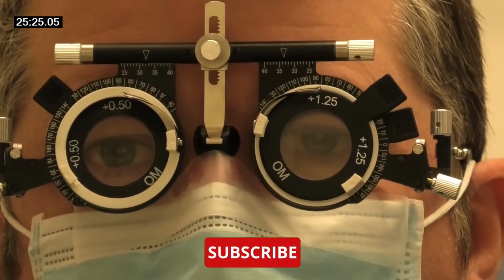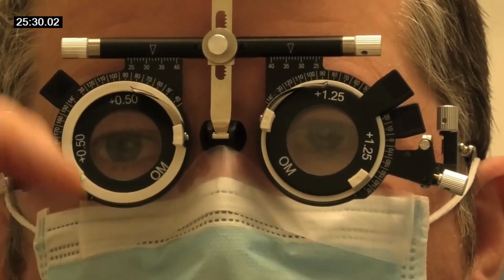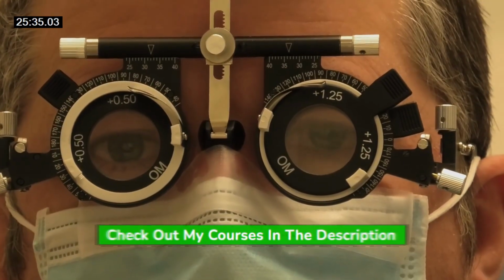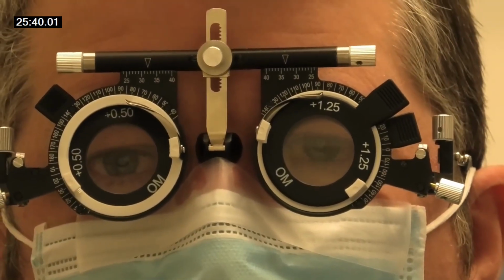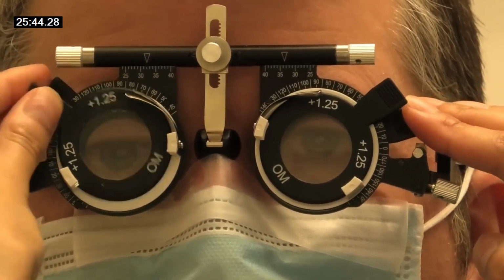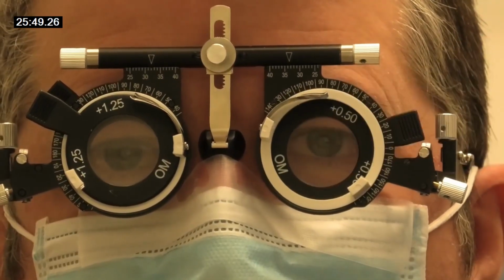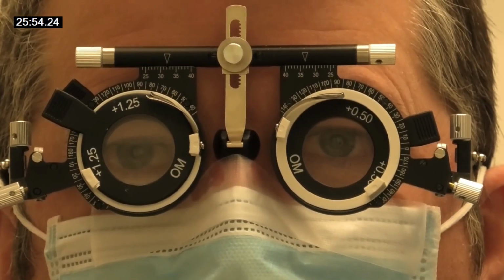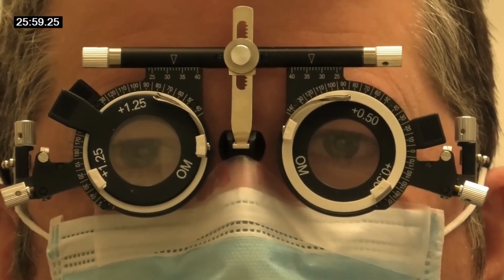And then we just want to double check that by blurring this eye, doing that eye again, and then doing both of them again. Sometimes what happens with these long-sighted people is that it gradually goes up. As they relax their eyes, it gradually goes up. Okay. And do the circles look clear on the red or the green? They do actually look clear on the red this time. That's good. On the red. So that's what we want.